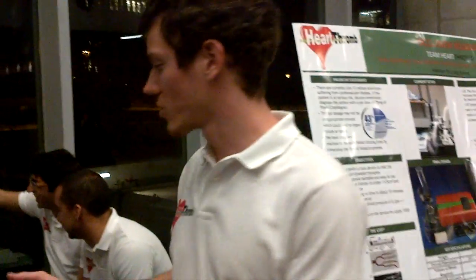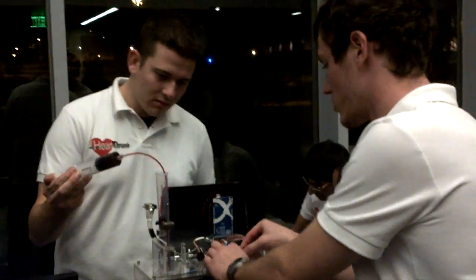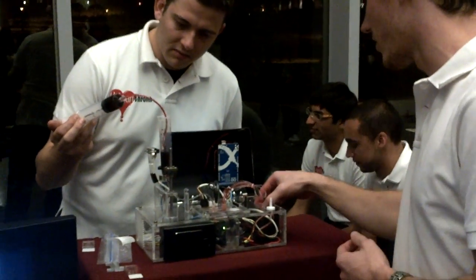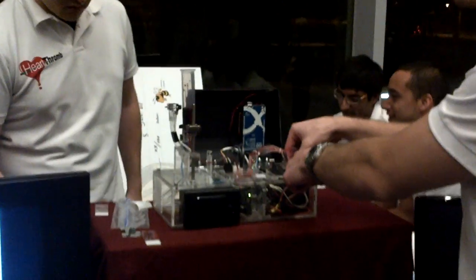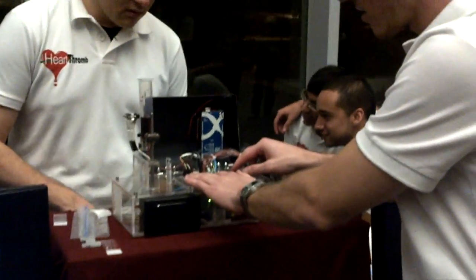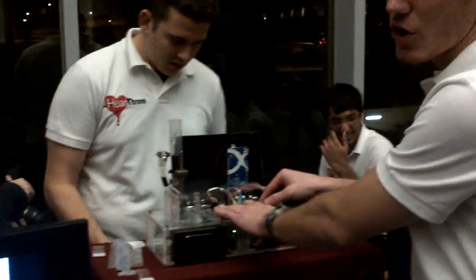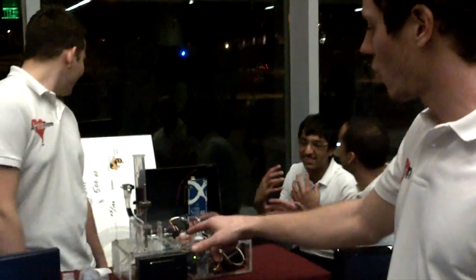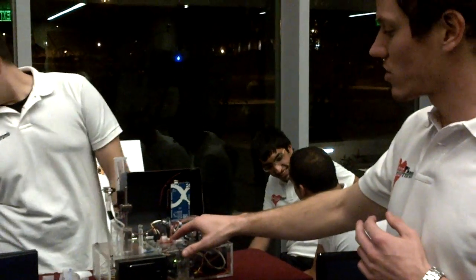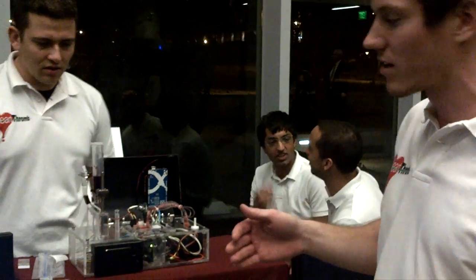So the lab practitioner or the nurse would take the syringe, place it in this adjuster, this pressure monitor, take the bag and slide it down into this hole. Take the chip, slide it underneath the light source and the photoreceptors. And this clip holds it into this corner to make sure that the sensors, the channels, and the light are all perfectly aligned to make sure we get the most accurate reading.